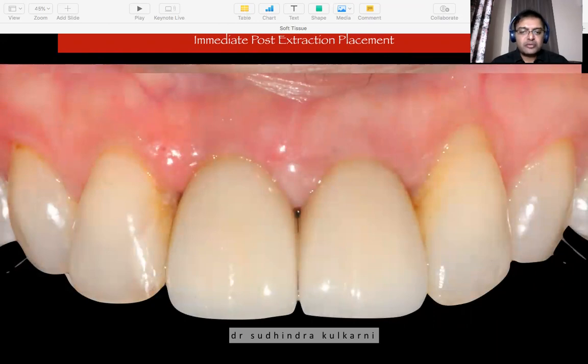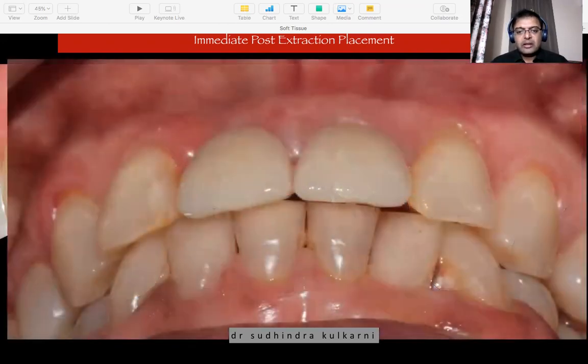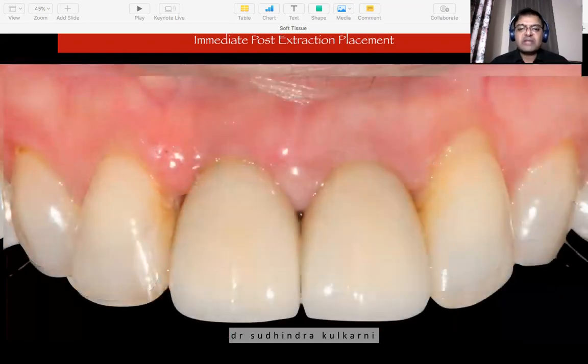So by the time I restore this case, I'm using the temporaries as an impression coping. And when I finish and restore this case, I still get a nice contour around my teeth, around the implants, and the peri-implant mucosa looks very, very nice, neat, and healthy. And I have a papilla. I have a proper shape, I have a decent stippling, and I have a decent amount of bulk around these dental implants.